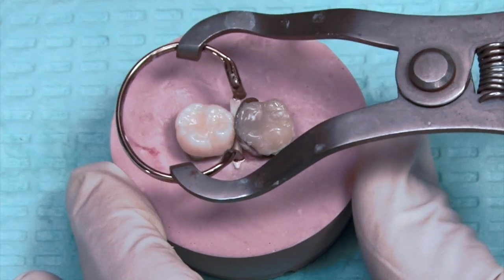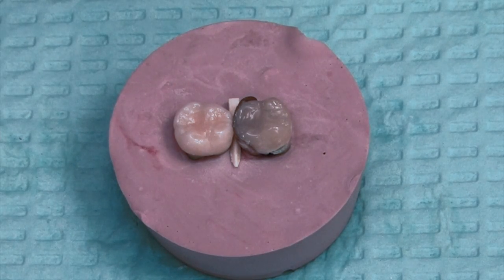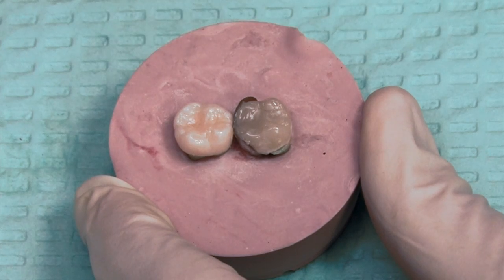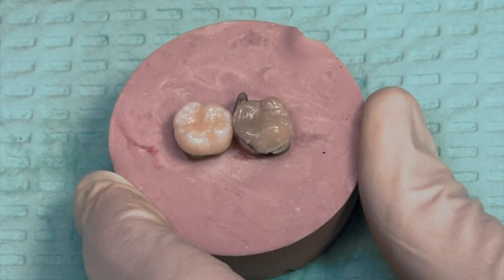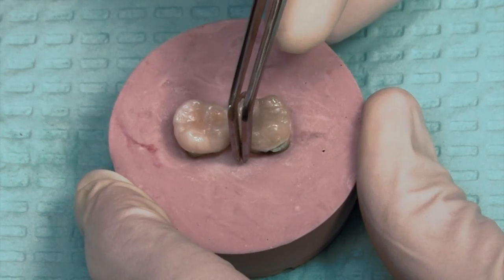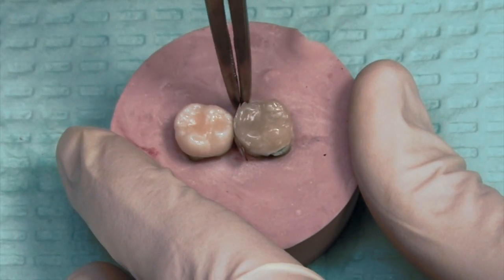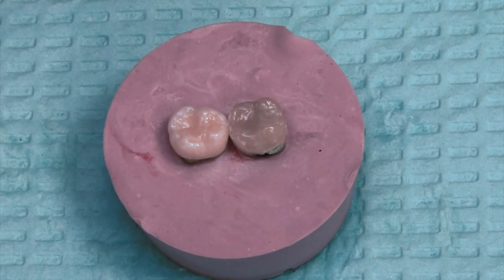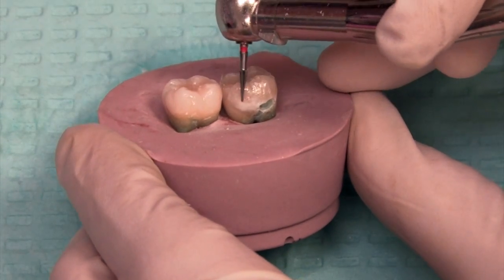Go with the ring forcep and remove the ring. Pop out the wedge. A lot of times the sectional matrix is going to stick to the composite that was placed. You have to free up as much of that as you can before actually lifting it out of position. I'll use a flat instrument to free up the buccal or lingual side and try to pull it out. Can't do it with the cotton forceps, so moving in with the hemostats — grab an edge, lock it into place, and start pulling. Even with these two teeth in the block with no PDL ligament to allow spreading, we got a pretty nice contact by using the bitine ring and pushing with the contact former.